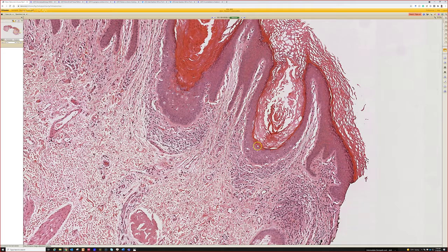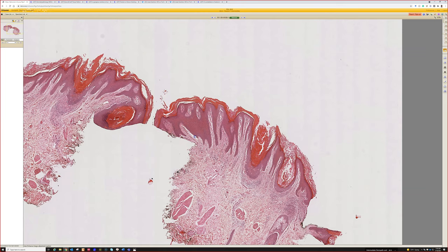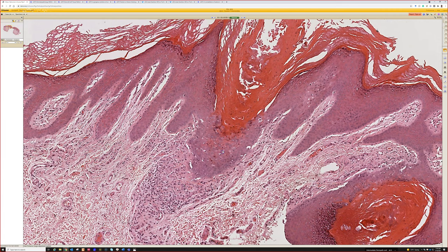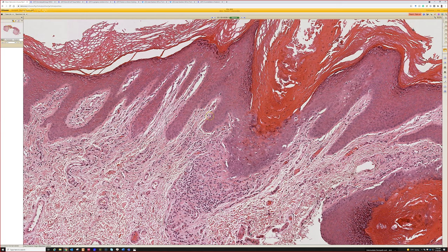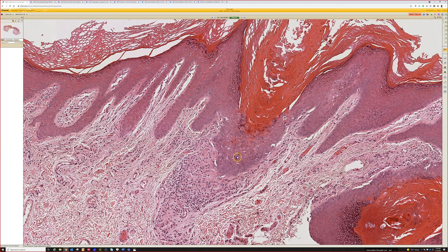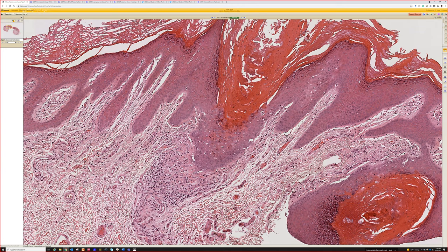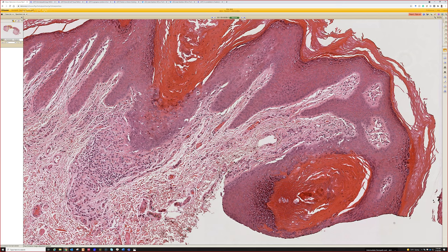The epidermis also shows a lot of acanthosis. What if I told you this was in the gluteal cleft? It's the ptychotropica type. Porokeratosis ptychotropica, which tends to be thicker and acanthotic, often is in the anogenital area or folded sites of the body. It tends to have, in addition to acanthosis, multiple cornoid lamellae. I've seen other porokeratoses with multiple lamellae as well. The variant doesn't make a huge clinical difference, but just to know that it is a variant of porokeratosis that is thicker and is in fold sites.